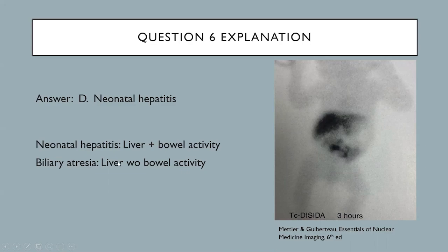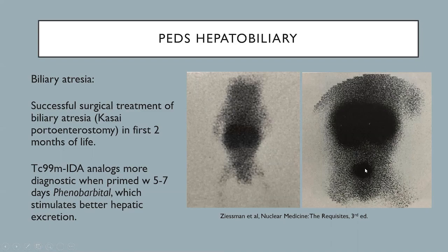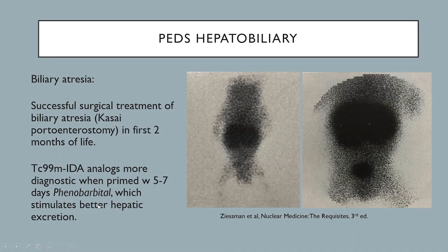This example of biliary atresia shows significant activity in the liver on initial imaging but no activity in the bowel. 24-hour imaging again shows significant liver activity and some activity in the urinary bladder, but no activity in the small bowel — confirming biliary atresia. Successful surgical treatment with the Kasai procedure in the first two months of life may help. Technetium-99m IDA analogs are more diagnostic when the liver is primed with five to seven days of phenobarbital, which stimulates better hepatic excretion.